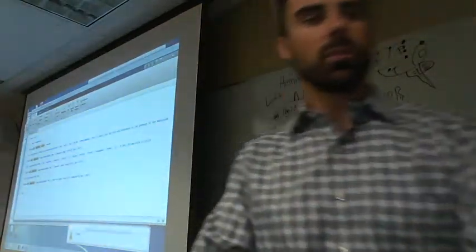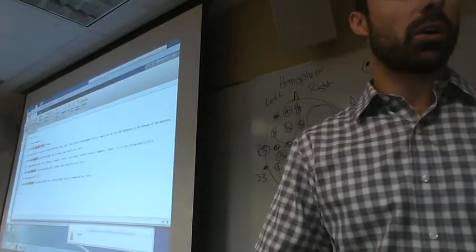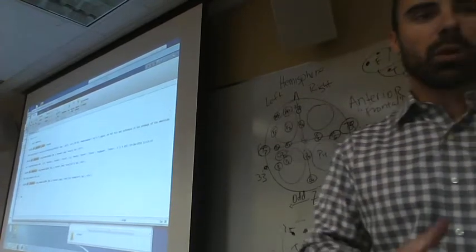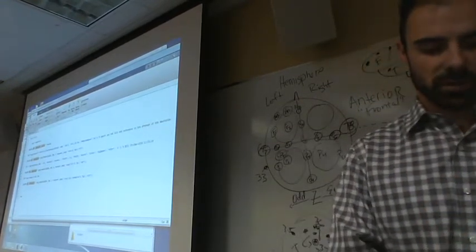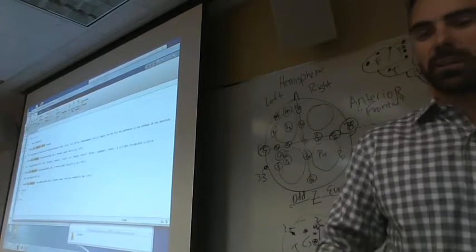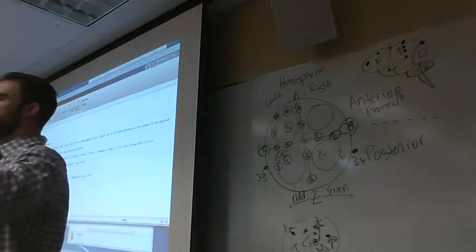So what we're going to do, at the bottom here, why don't we just type clear all, just for fun, and we can do CLC again, just so that it clears out all of our variables in the workspace and restarts for a new subject.